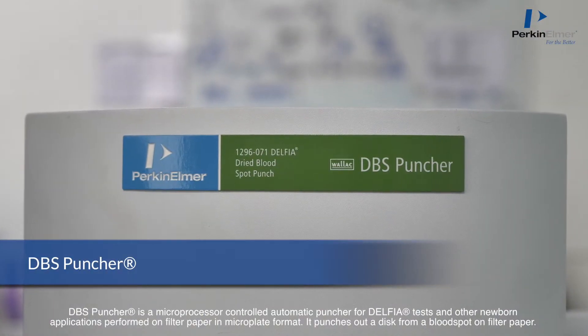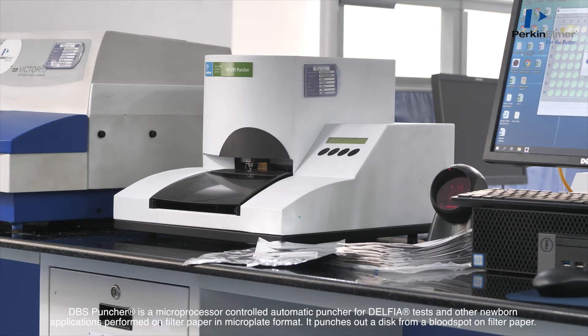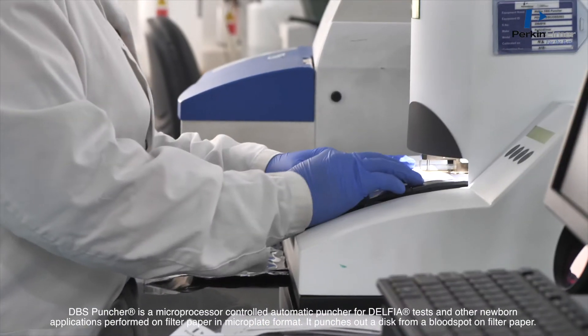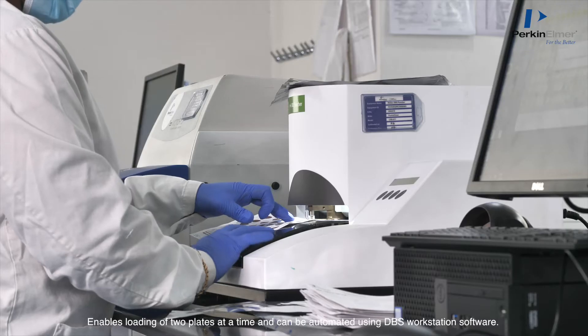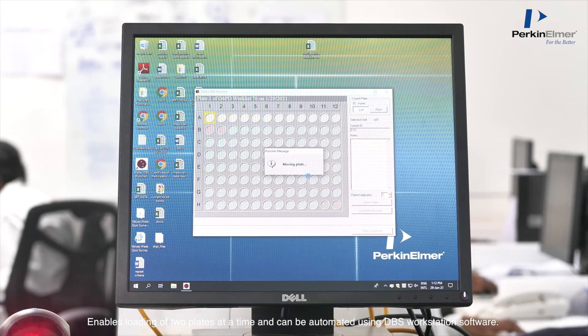The DBS Puncher Instrument is a microprocessor-controlled automatic puncher for Delphia tests and other newborn applications performed on filter paper in microplate format. It punches out a disc from a blood spot on filter paper, enables loading of two plates at a time, and can be automated using DBS workstation software.